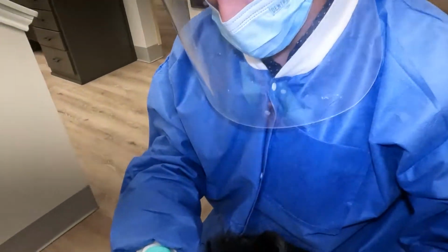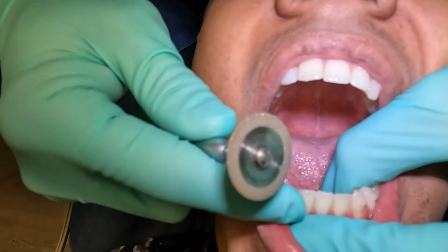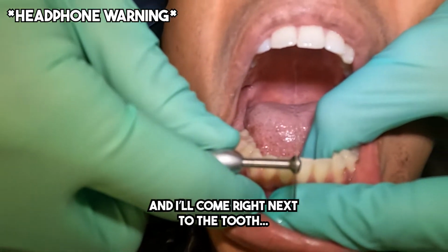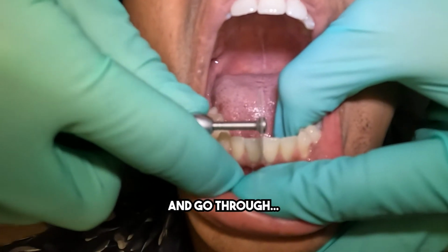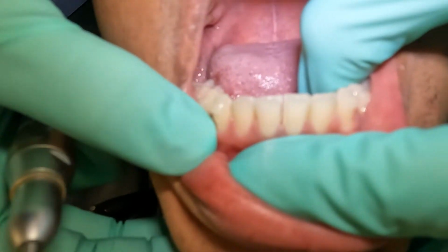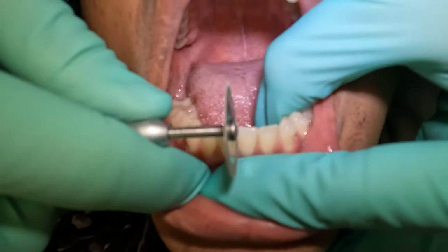What I like to do is I get my finger right here and this little disc, remember it spins. Just like that. And I'll come right next to the tooth and start buzzing just like that. And it goes through. And look at that. Can you see that? The little space that we created? Very small. Very small. Oh yeah, Nish gets to watch too.